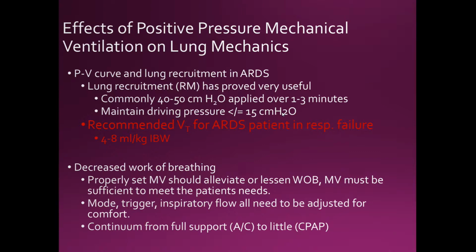There are times where we want to distend the alveoli, not overdistend. We want to distend it for some time so that gas can exchange and we can blow out that CO2. Now again, with our ARDS patients, they have stiff lungs, so keeping that pressure there for 1 to 3 minutes is not going to hurt them, it's not going to kill them, but it's going to help them tremendously because they're able to ventilate.